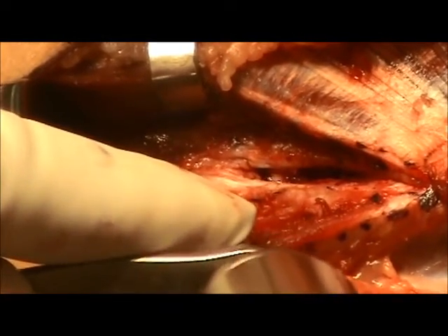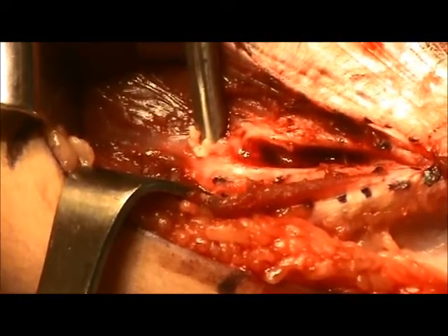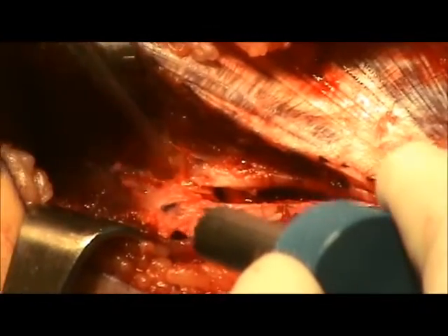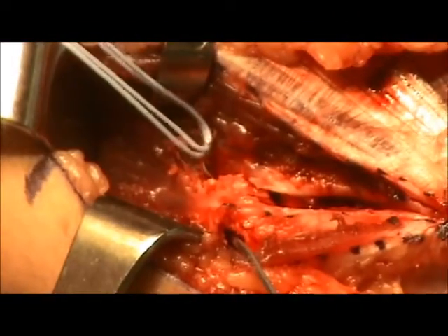Converging bone tunnels are then created with a 3.5 millimeter drill. The bone tunnels are then connected with a curette, and care is taken to ensure that at least 8 millimeters of bone bridge is achieved to avoid fracture. After connecting with the curette, there is a chamfer tool that can be used to take the sharp edge off of the bone, which will create less injury to the graft once the graft is passed. Next, a suture passing device — a malleable wire — is passed across the bone tunnel, and through this device sutures can be placed. This loop suture will then be used later for graft passing. Sutures can also be used to test the integrity of the bone bridge by applying slight traction across the bone tunnels.